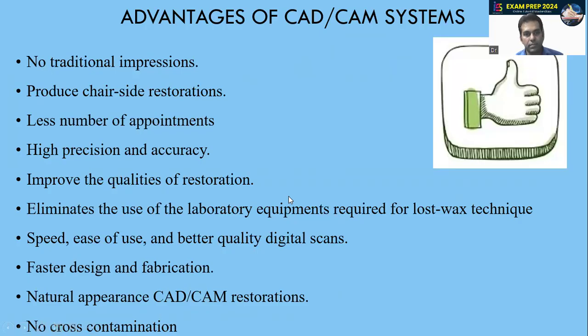Now, regarding advantages of CAD CAM, first of all, and the most important thing, no traditional impressions are required. As we all know, we are using intraoral scanners for most of the cases, and that is why there is elimination of the impression procedure, and that is the basic advantage.